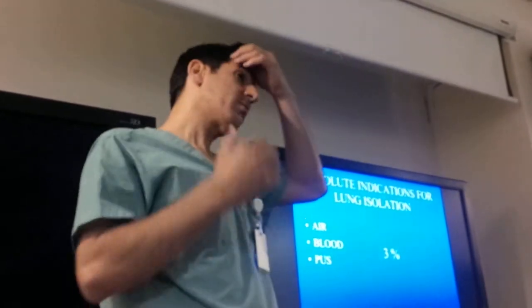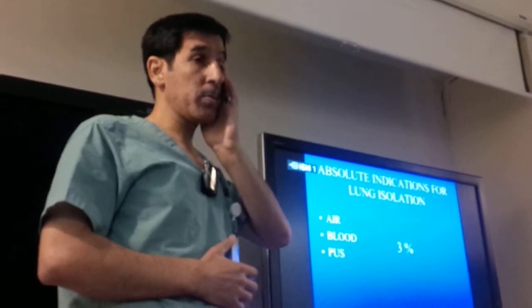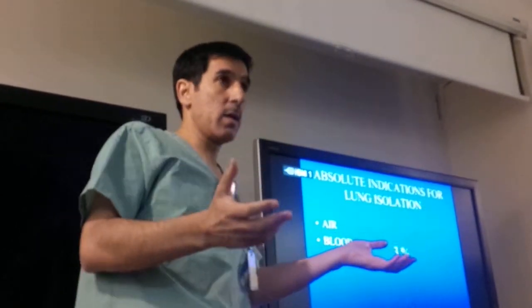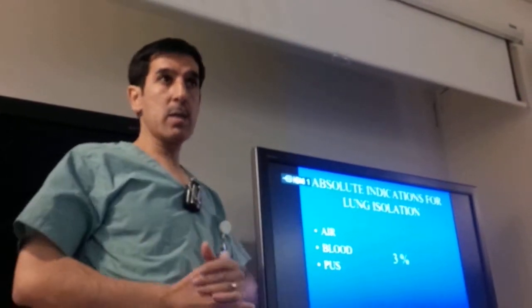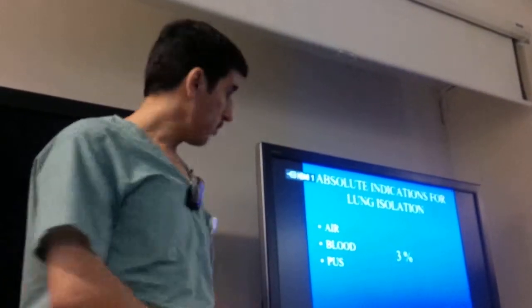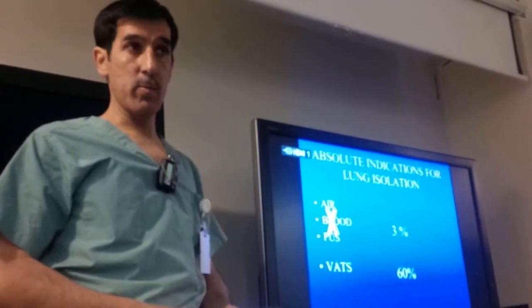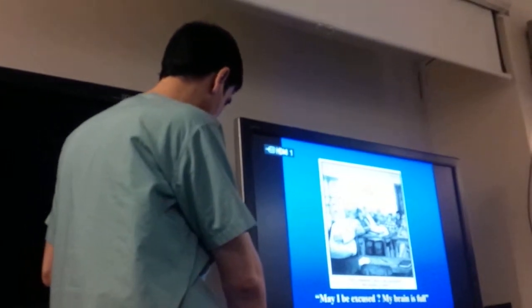Now this is before the introduction of thoracoscopy. Imagine now you don't have fiberoptic and you have done a thoracoscopic procedure and the isolation is not good. The surgeon cannot see, he cannot manipulate the lung. Then they have to open and retract. It's not acceptable to change the procedure from thoracoscopy to open because you don't have bronchoscopy. Now we can say this concept has completely changed. Now the absolute indication is more than 65% because of the video system.